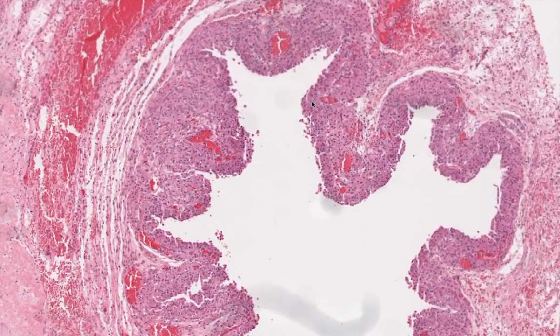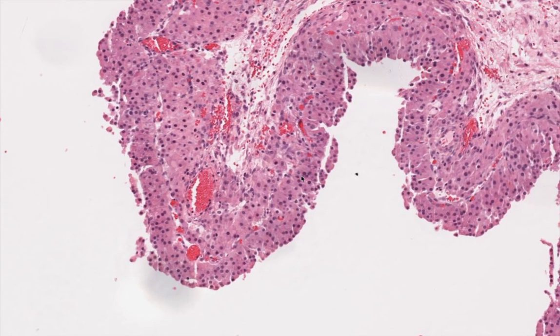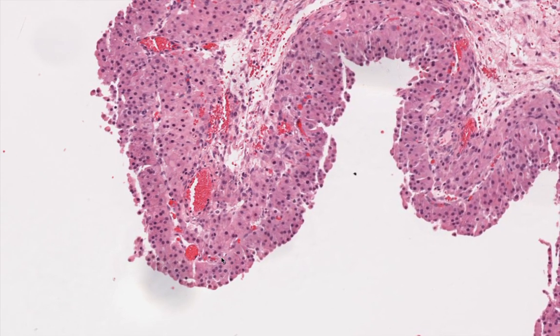What is happening? Looking here, we can see that it is lined by cells that appear to be in two layers. Inside we've got these granulosa cells and then the thecal cells. So this is a corpus luteum.